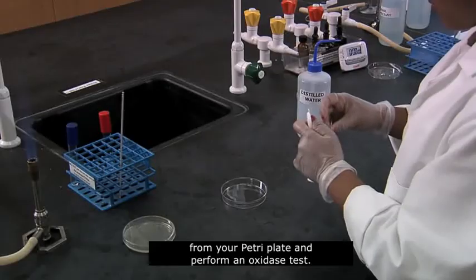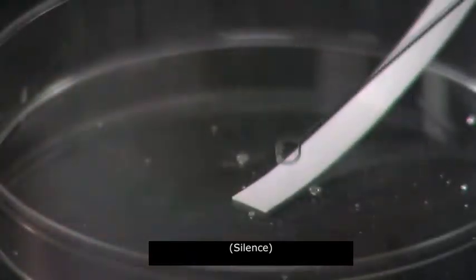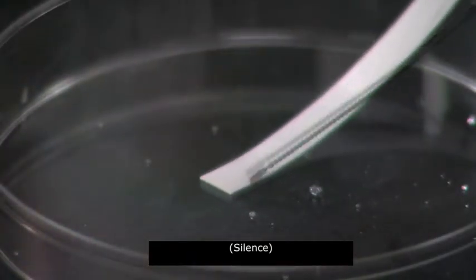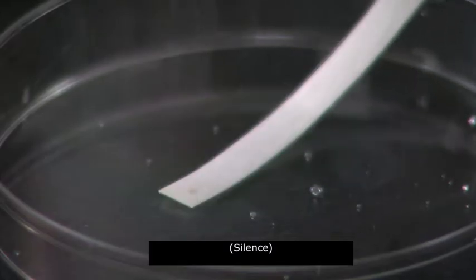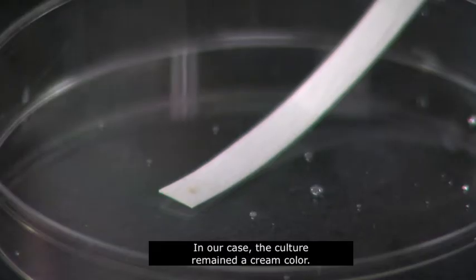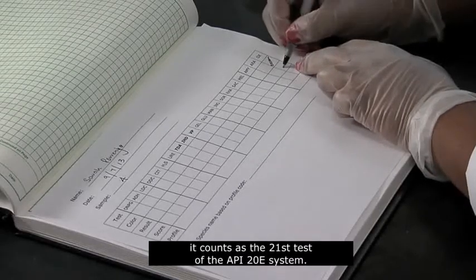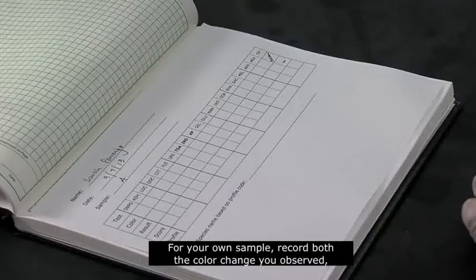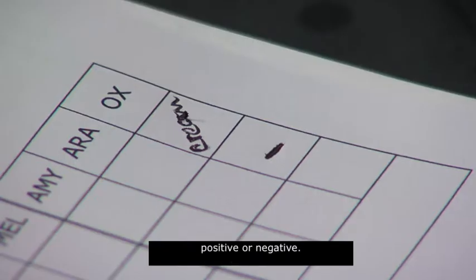During this incubation period, take another colony from your petri plate and perform an oxidase test. In our case, the culture remained a cream color. We interpret that result as negative. Although the oxidase test is not part of the strip, it counts as the 21st test of the API-20E system. For your own sample, record both the color change you observed, if any, as well as your interpretation, positive or negative.